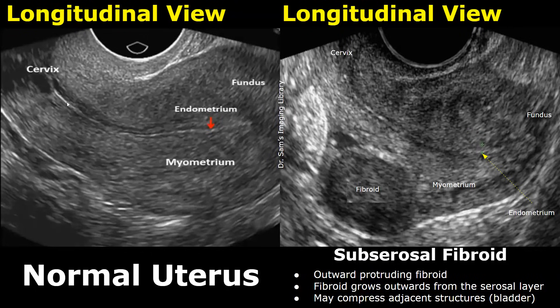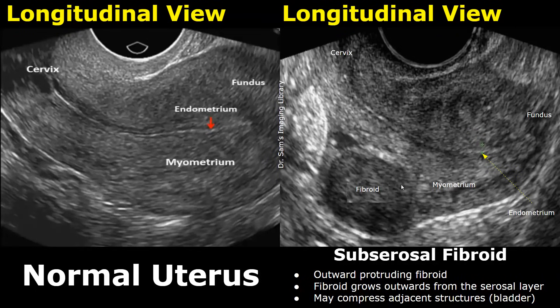And this is a subserosal fibroid. This type of fibroid grows outwards and distorts the contour of the uterus. It may compress adjacent structures such as the bladder. If we see this type of fibroid, it is a subserosal fibroid.